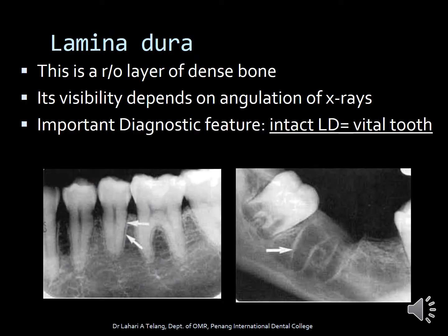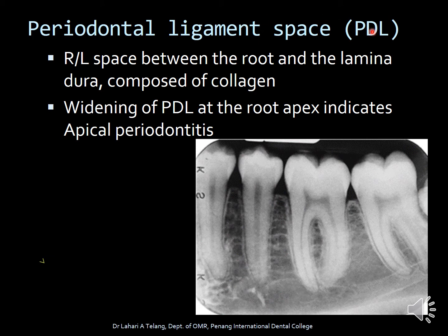Next, we move on to lamina dura. Lamina dura is an important radiographic entity — it is a radiopaque layer of dense bone whose visibility depends on the angulation of x-rays. An intact lamina dura indicates the tooth is vital. The white arrow marks here show the white line around the tooth which is the lamina dura. This case shows the socket left after extraction — a fresh socket — with an intact lamina dura. Eventually, as bone remodels in an edentulous area, the lamina dura will cease to exist and merge with normal bone. The PDL, or periodontal ligament, is the radiolucent space seen between the root and the lamina dura, composed of collagen and soft tissue — which is why it's radiolucent.